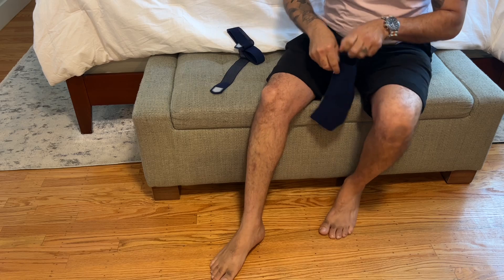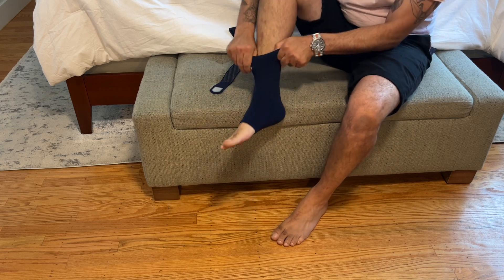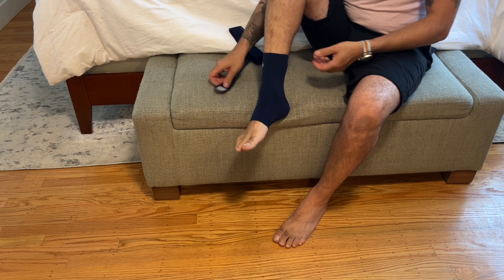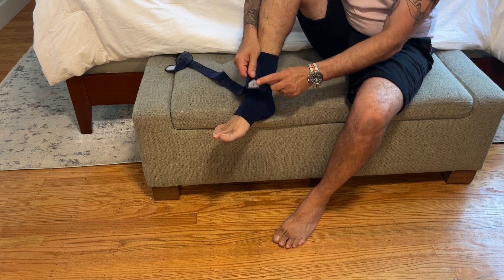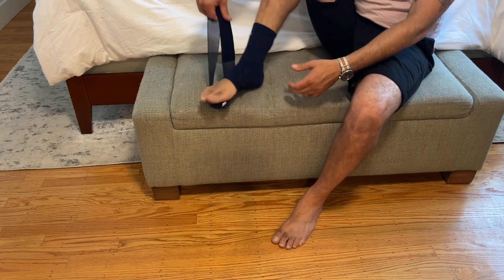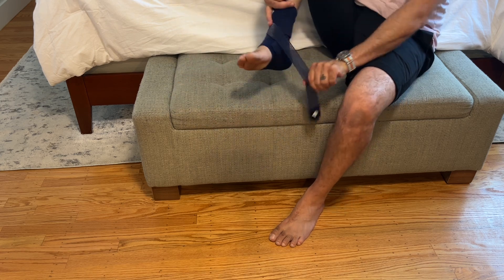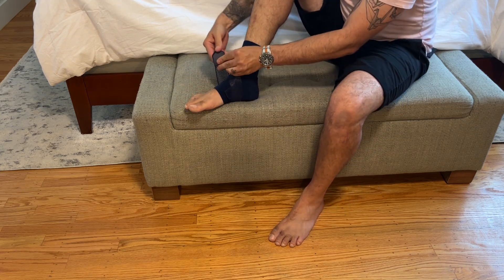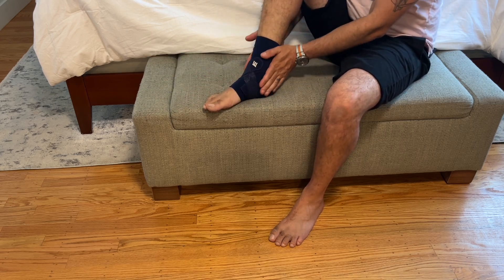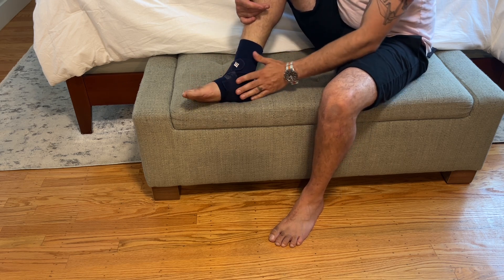Let me show you how we put it on. All we do is slide our foot in, making sure we're coming up to the heel portion and that the first velcro piece is right at the arch of the foot. Now we're going to line up that number one velcro right here — same shape to shape, really easy. We're going to go under the foot, around the ankle, back around, under again, keeping it tight, come back up and velcro this down. Just like that — really simple to put on, but gives you great compression: X-style compression all the way through your ankle, under your foot, with plenty of arch support.